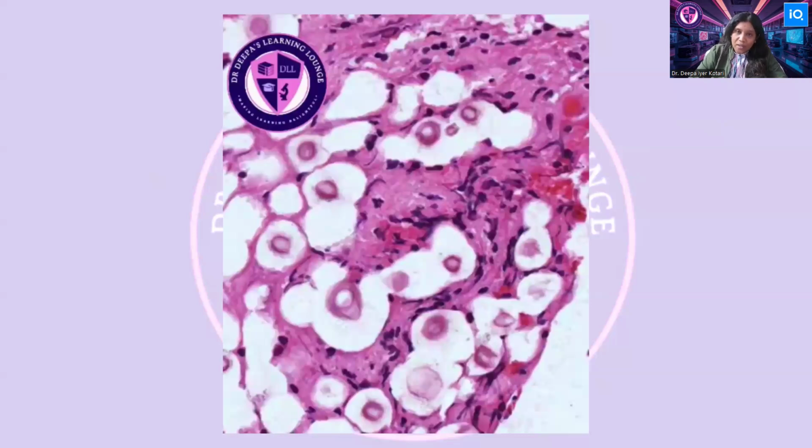The size of the organism is half the size of Cryptococcus. Another important differential is that the capsule is not present, so mucicarmine is negative in Histoplasma. When you see numerous tiny organisms which are tightly packed inside macrophages, your doubt should go towards Histoplasma rather than Cryptococcus. And mucicarmine is definitely a differential stain.